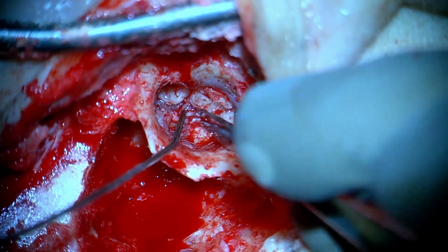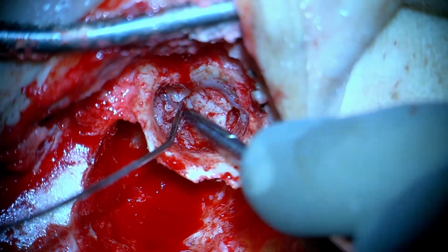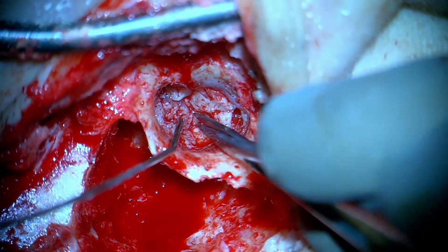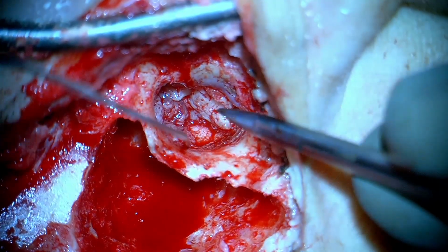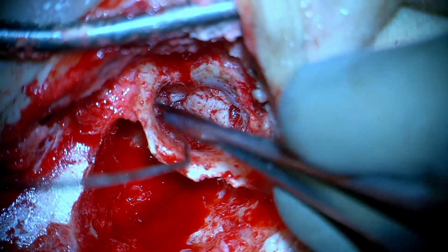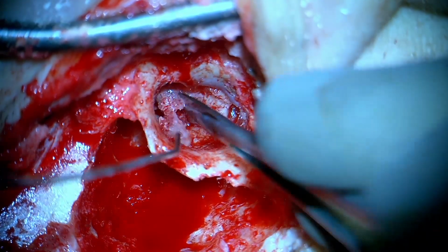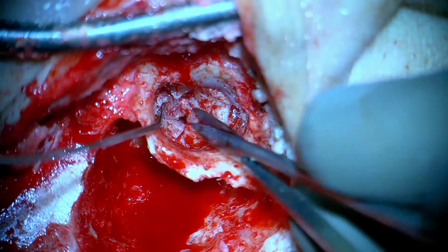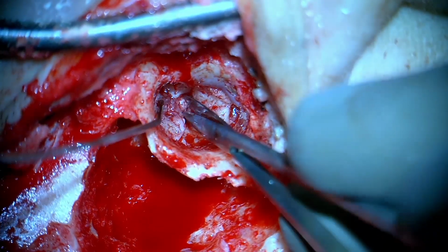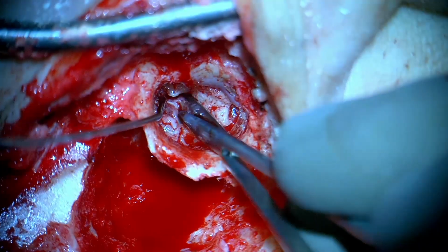Now we're going to resect the entire bunch of the granulations and the unhealthy or diseased mucosa that harbors infection before we put the tympanomeatal flap back. That would lead also to a defect, which of course we will bridge when we use the temporalis fascia for grafting.